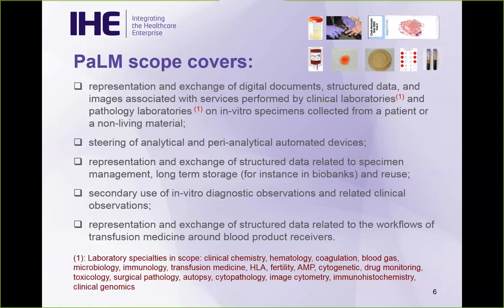It looks at the proper representation of structured data for the specimen management and storage, as well as dealing with sending or using laboratory data in other domains of the healthcare enterprise. And that kind of falls into overlap a little bit with public health domain, for example. So we sometimes work together across domains. And as you'll find out, we also work with outside standard development organizations, like for digital pathology, for example.